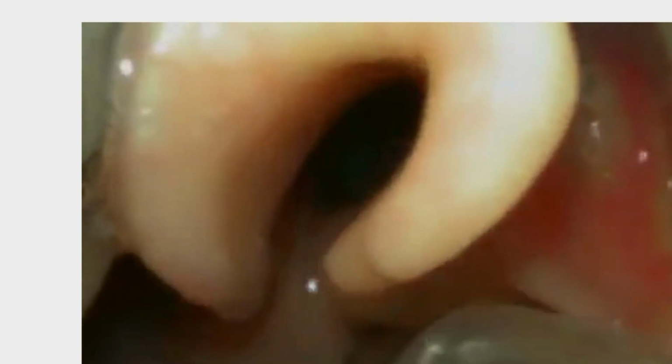There is something called an omega shaped epiglottis, where you see the epiglottis like this, omega shaped. So you don't have a clear cut view of the cords here. They will be seen at an angle like this, a crossed angle. In that situation, even though you call it a CL 2 view, sending the tube is very tough because the angle is like this. In those situations, the bougie will be very helpful. You can see, first the bougie has been sent and then the tube.